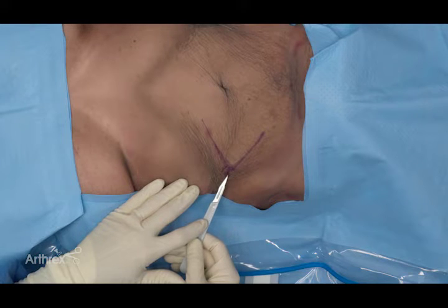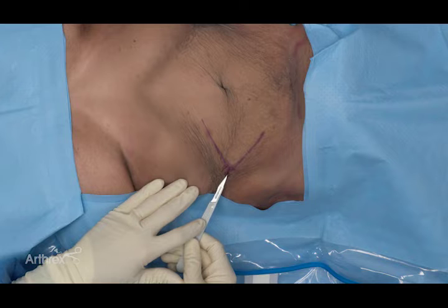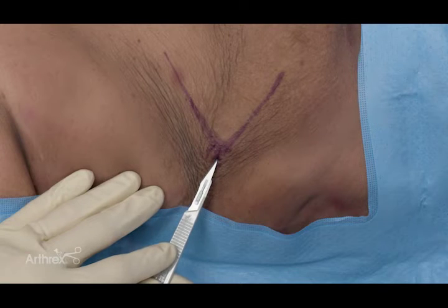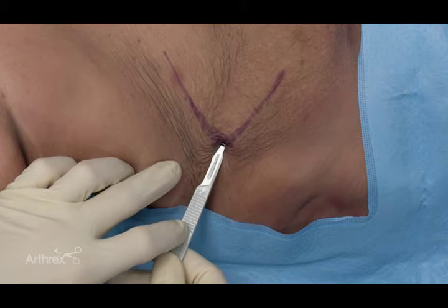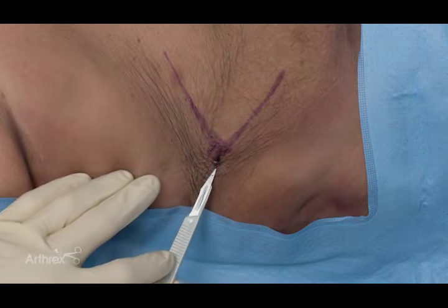We've let the lidocaine sit for one to two minutes for full anesthetic effect and we're ready to make just a poke incision — exact same trajectory and plane as our anesthetic phase. The scalpel goes in very gently, just to make our incision.